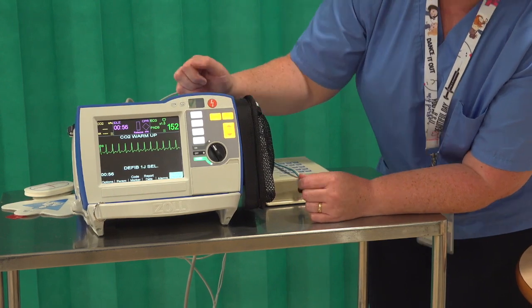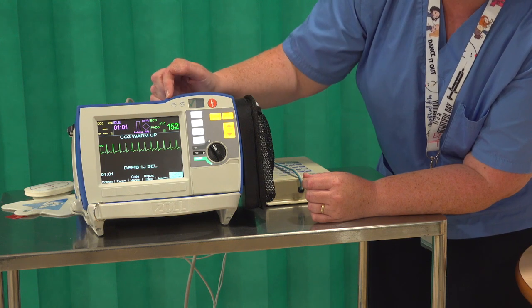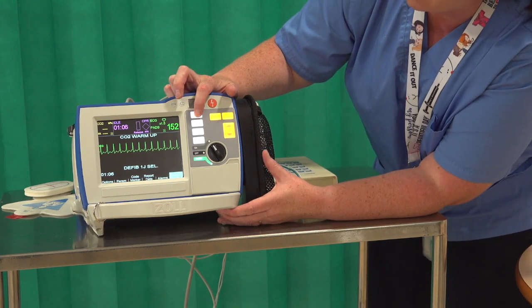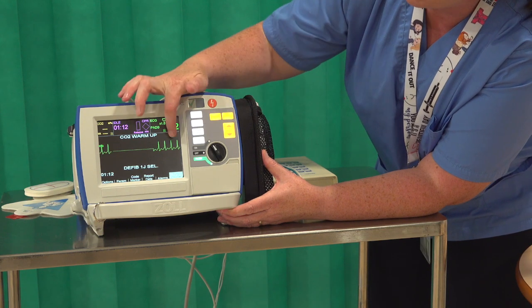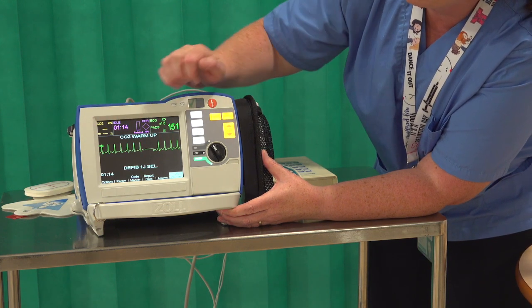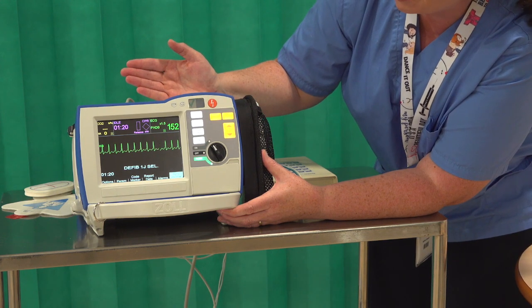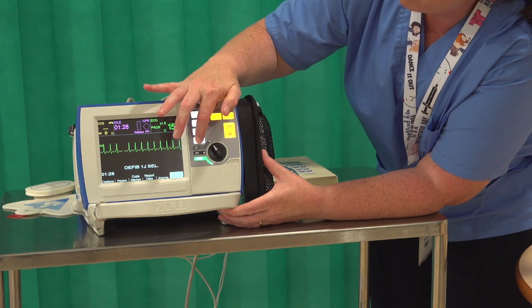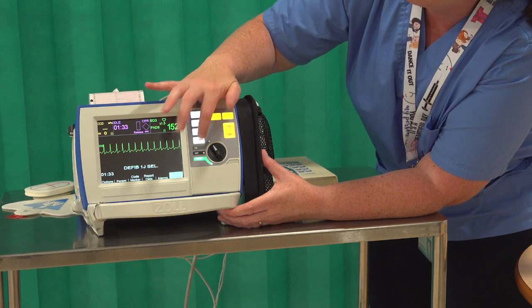There are additional buttons: the lead button lets you monitor via three leads — the machine defaults to pads, but you can change to lead one, two, three, or back to pads. The size button changes the amplitude of your complex. Alarm suspend — the alarms are turned off initially but you can action and turn them on with that button. The record button is quite important: hit record and you get a strip of your rhythm; hit it again and it turns off.